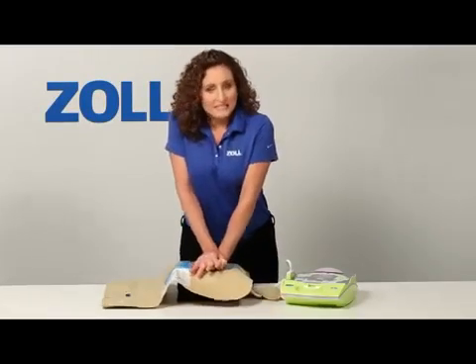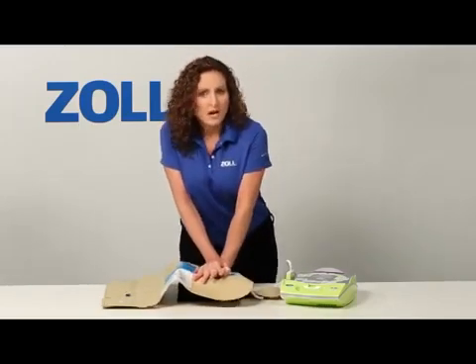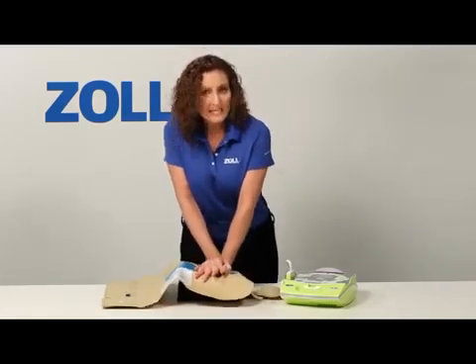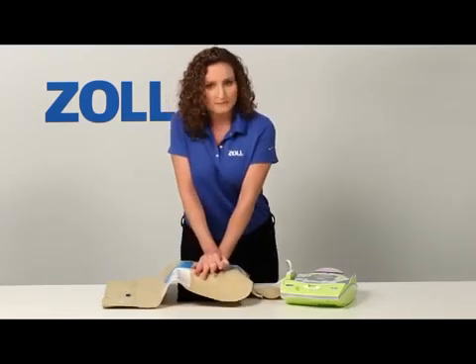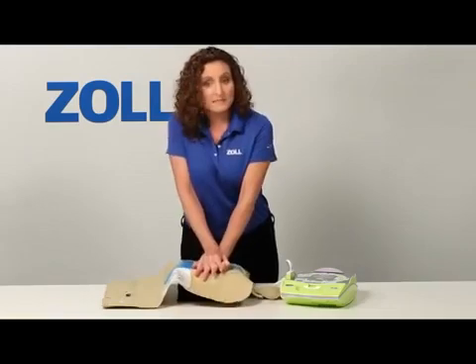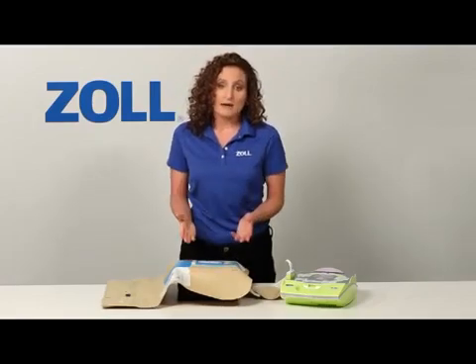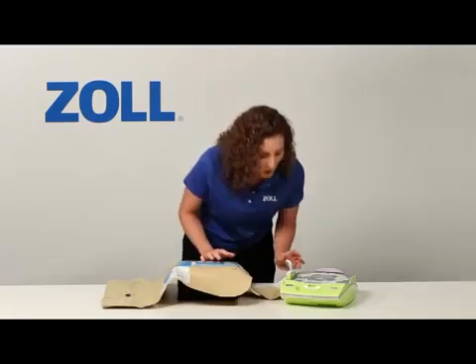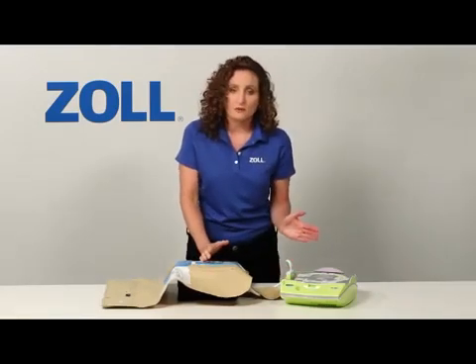The 2010 American Heart Association guidelines for CPR recommend a compression to ventilation ratio of 30:2 for trained lay rescuers. Untrained lay rescuers can provide hands-only CPR. If you do stop compressions, like I am now, to give 2 breaths, the metronome stops.